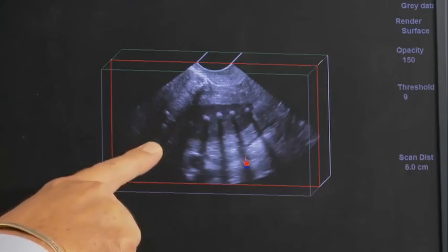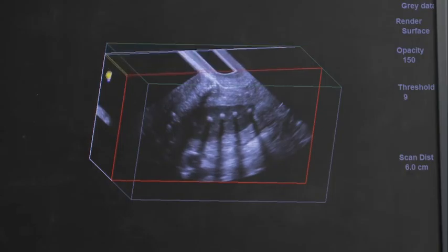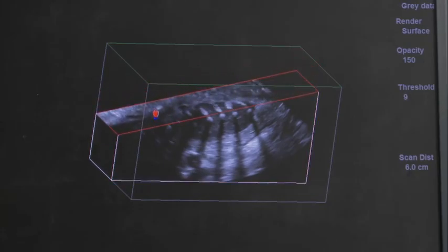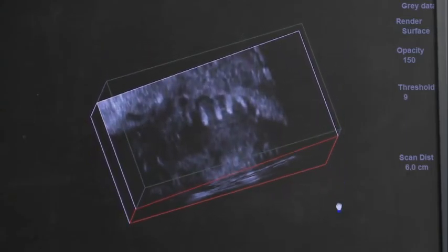If the endometrium is not horizontal in the sagittal plane, grab one side of the coronal plane, left or right, with the yellow fist and angle down to match the angle of the endometrium. Then, reload the data in the sagittal plane using the parallel shift or translating technique. Rotate the cube to visualize the coronal plane and translate to the level of the endometrium.